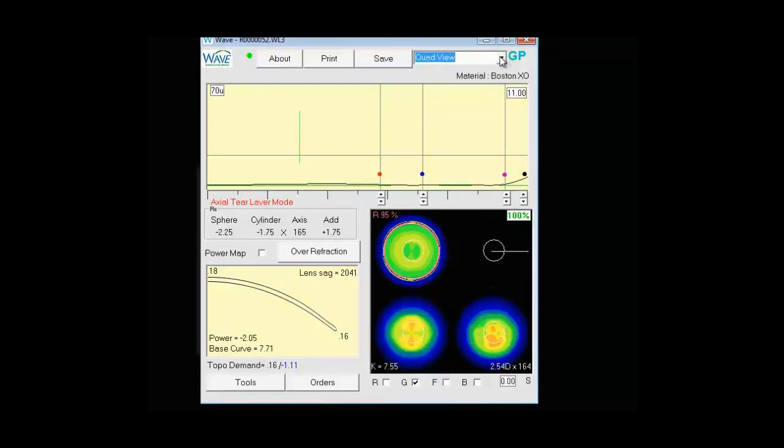Next, we have this drop-down. It defaults to quad view. Quad view is referring to what we're seeing in this lower right corner here. So quad view is showing us four views all at the same time. This is the most often used when you're designing your lenses.